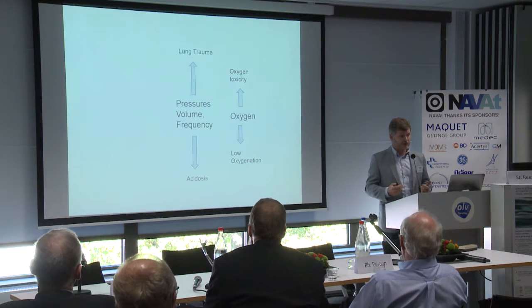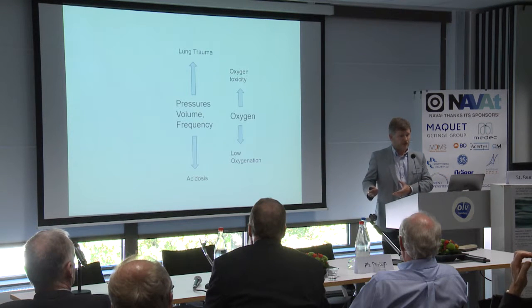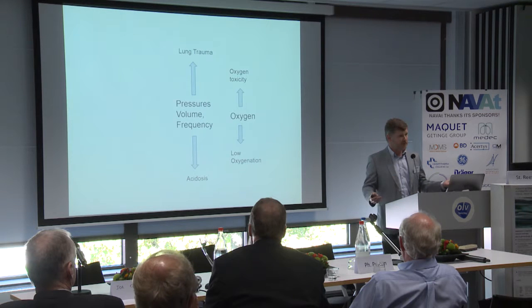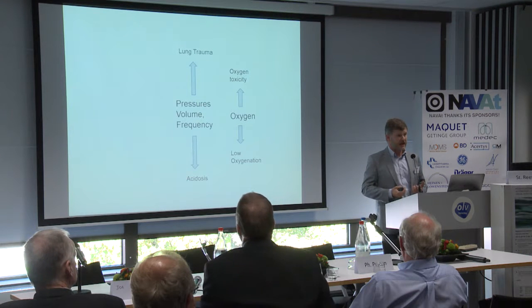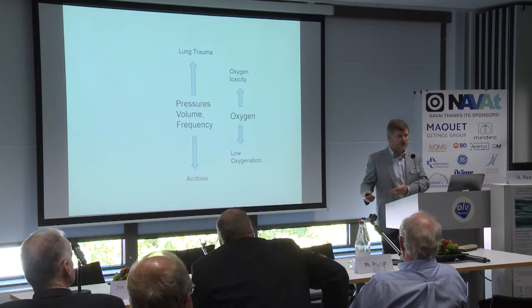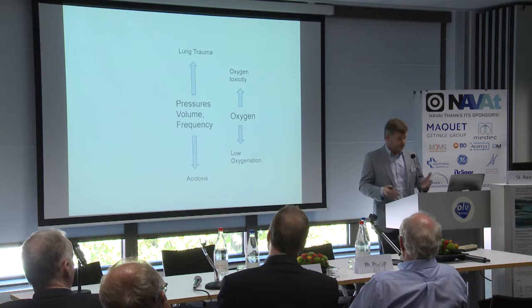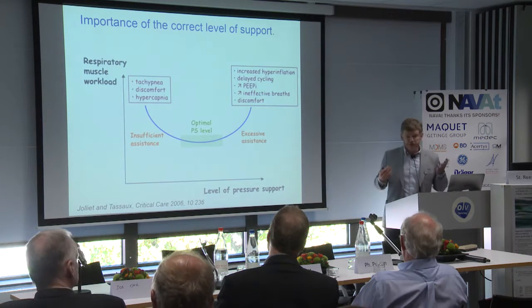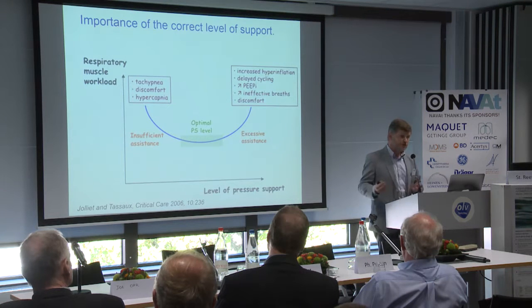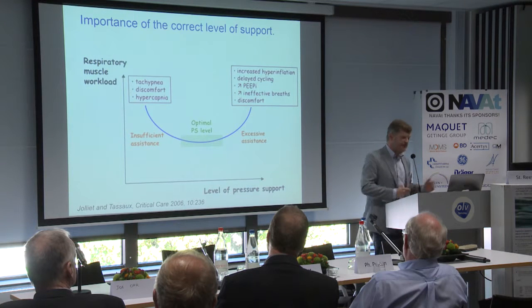If you have stiff lungs, you're protective on the pressures and volumes. If you have non-stiff lungs and very high CO2 production, then maybe you're willing to accommodate higher pressures and volumes. And this is why we see the trend to saying that tidal volume doesn't matter so much in healthy lungs, because, well, the compromise point is at a different position. We're trying to get rid of our CO2 effectively. But we have a balance. And thirdly, of course, once patients start breathing spontaneously, we have a balance on how we wish to support them. If we over-pressurize them, this is pressure support again, and I relate back to the ICU.